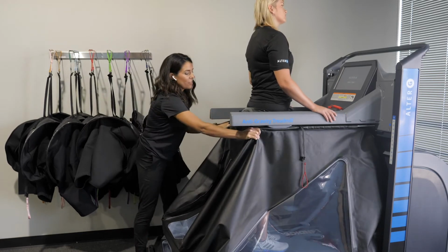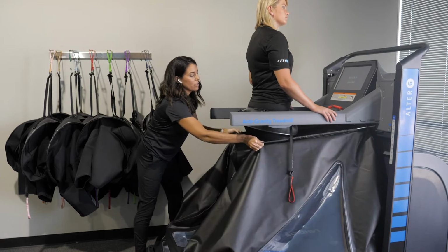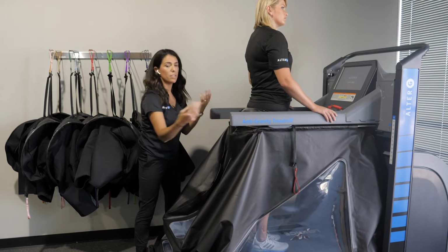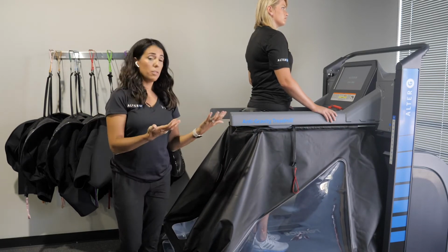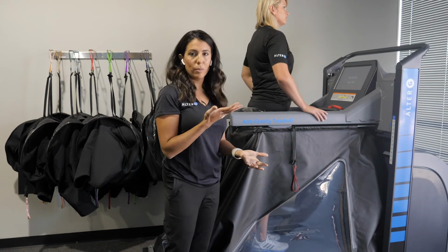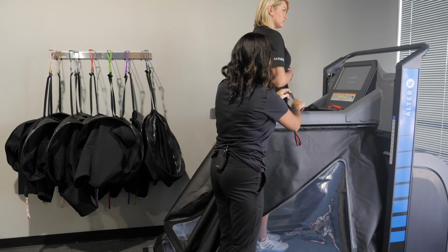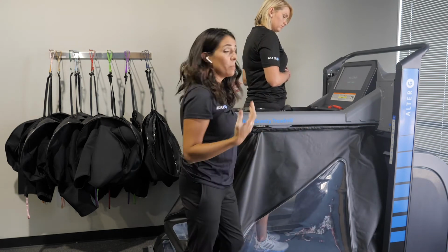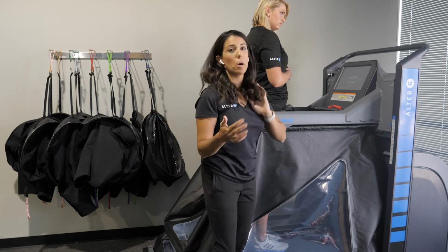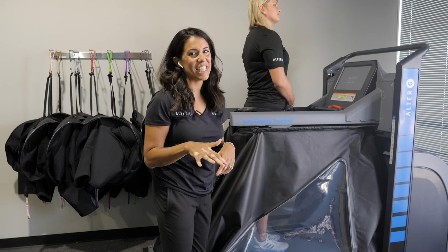Now, as you saw, to raise the bag, it's simply magnets on the underside of the rail. So all you have to do is lift up the 2 sides of the bag until they snap. These are high-powered, pretty strong magnets that will just secure the bag up. The next part is simply zipping in. This might be the hardest part of the treadmill use, and that tells you how easy it is to use.